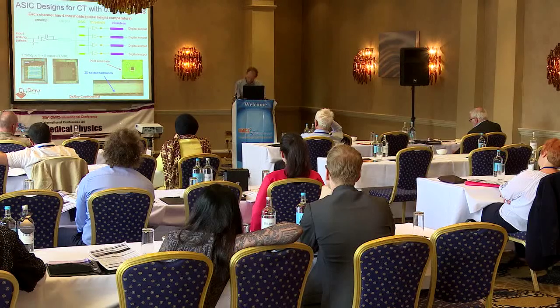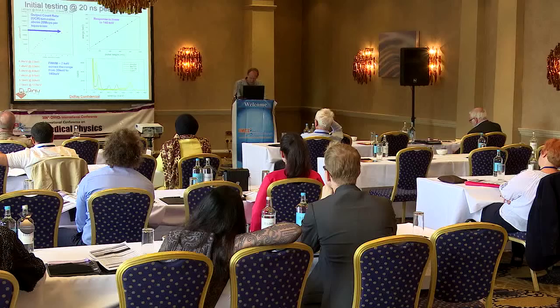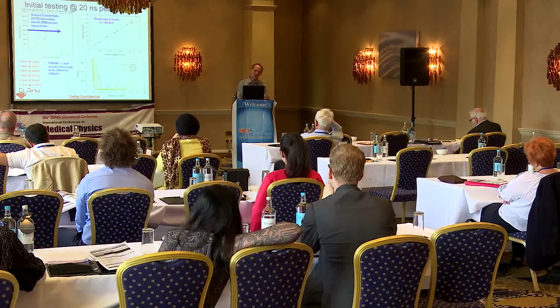Over here we see the achievement of the flip chip bump bonding on this small length scale. And so this increases the output count rate up to 20 million counts per second per square millimeter, and also provides a linear energy response across the entire dynamic range for CT.